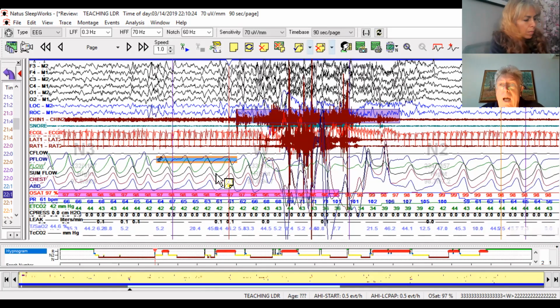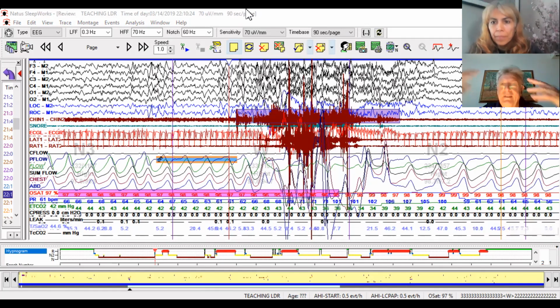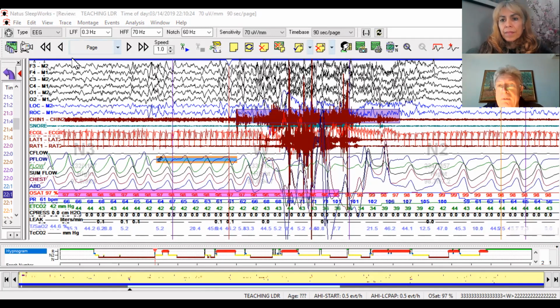I don't understand why leg movements with arousal are counted and considered in the PLMS index, while leg movements associated with the respiratory event should not. In my view, if they meet the criteria for periodicity, that means at least 4 movements with a determined interval, they should be counted and noted as associated or not, the same as arousal. And I will do the same for this movement.